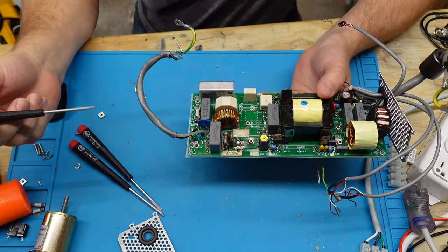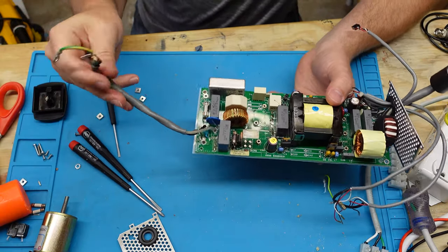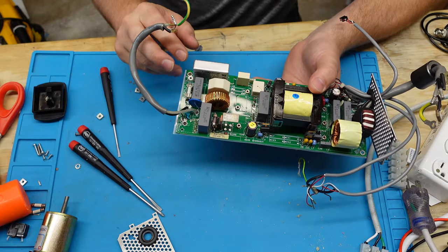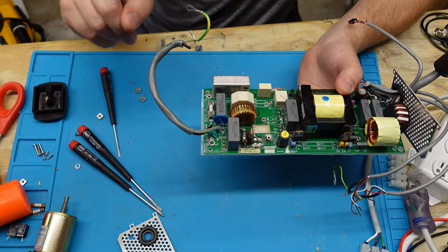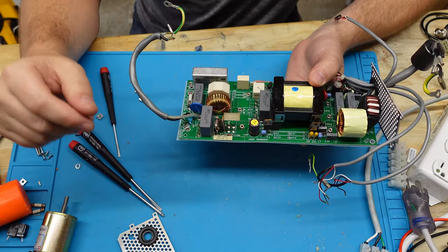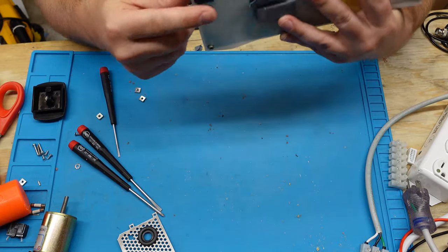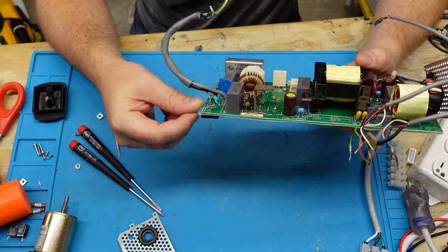Okay guys, well, let's take a look. So your AC power comes in right here on this side, and it comes through here. We have filtration, inductors and capacitors, and your main fuse, which there's only one fuse on this board, which, as you guys have heard me talk about, medical grade power supplies usually have two. Inrush current resistance and your bridge rectifier mounted right here on the bottom.